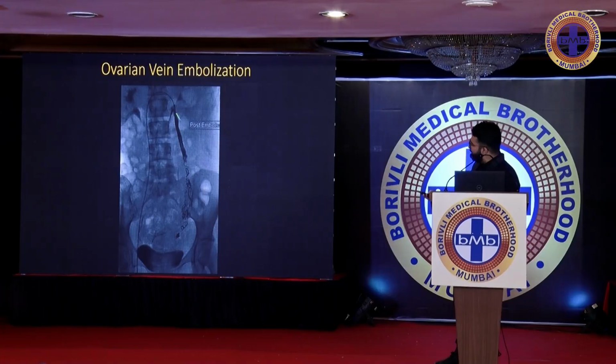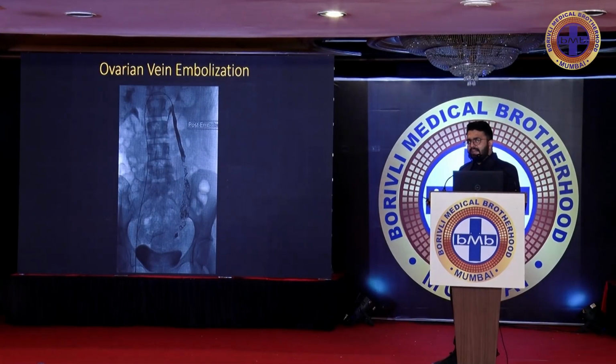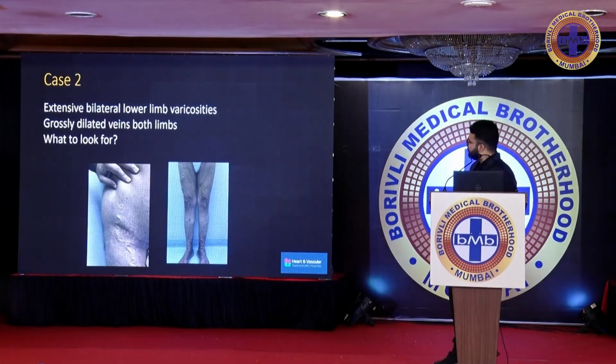So we went ahead and did an ovarian vein embolization for her. Her family was complete, so we could go ahead with this procedure. And with that, she had relief of her symptoms.